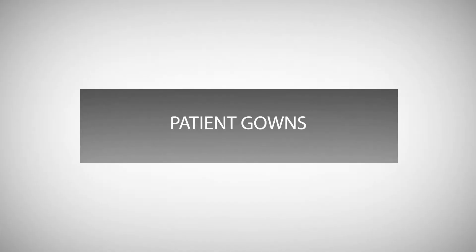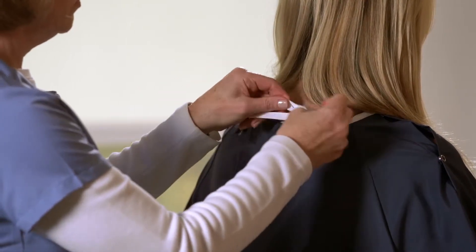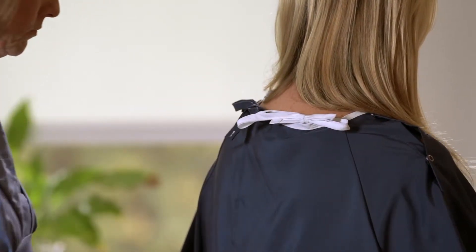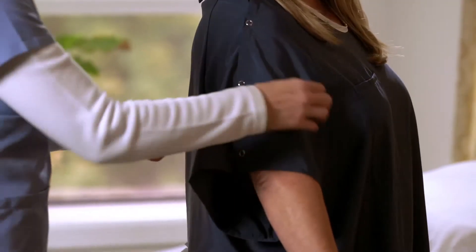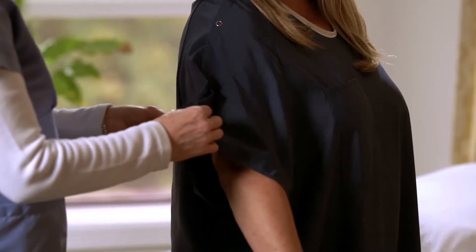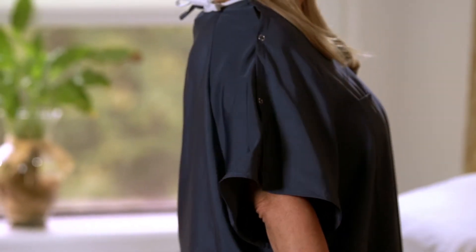Patient gowns. There are two standard sizes of Dermatherapy gowns. The navy blue is the standard size. An extra large size will also be provided. The IV gown has snaps that extend the length of the sleeve.